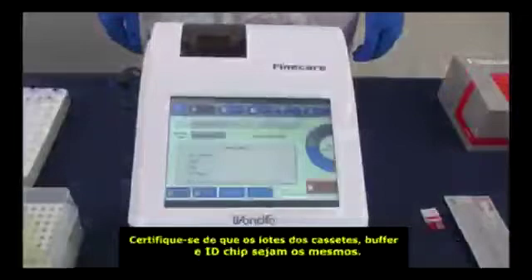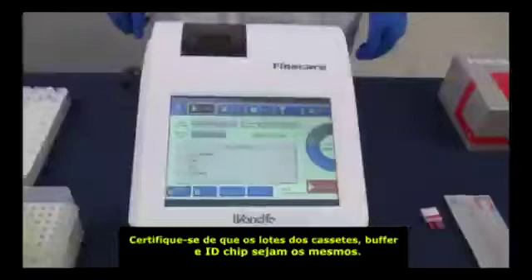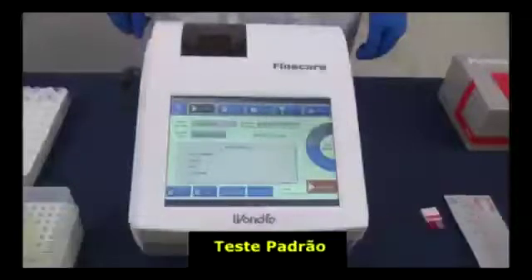Notice: first, the lot number of the test cartridge, ID chip, and buffer must be the same. Second, if stored in a refrigerator, the buffer should be equilibrated at room temperature for 30 minutes before testing.